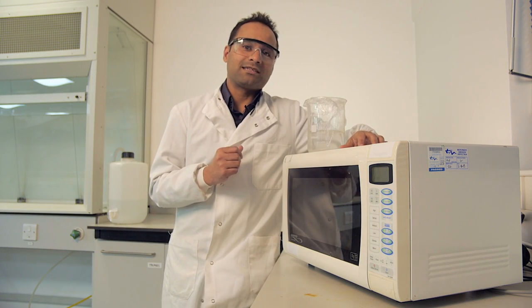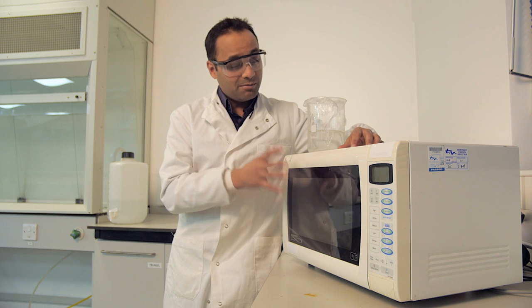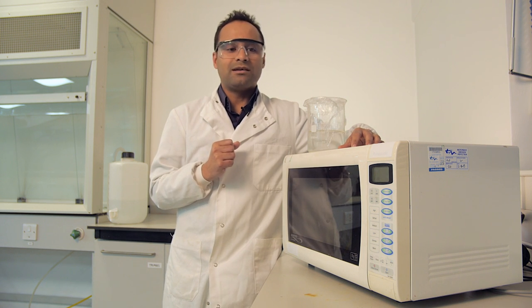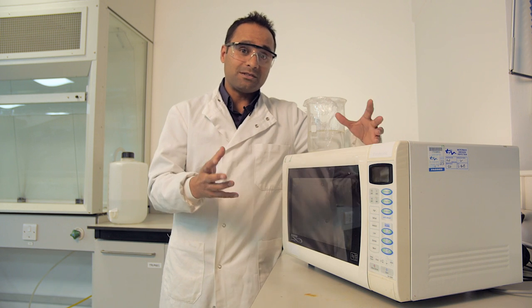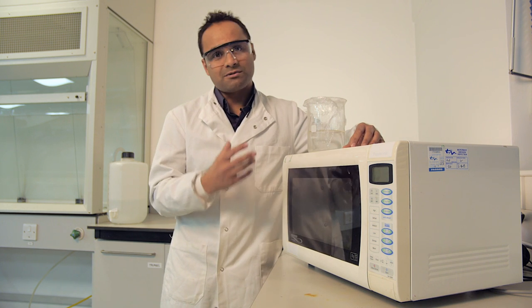One of the great things about this practical is you don't use an autoclave, but a microwave to bring this solution to a boil. You simply put it inside the microwave and heat it in short bursts of about two minutes, whilst watching carefully to make sure it doesn't boil over.